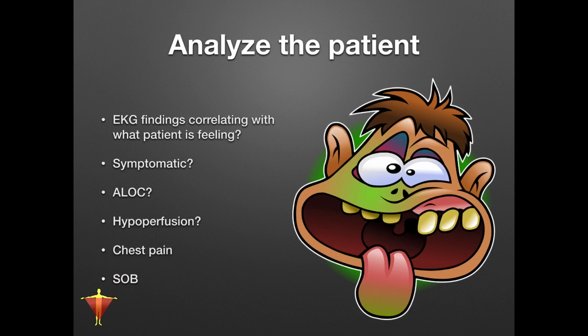Right? All these things are just things we want to be able to identify, because again, we're treating our patient. We're not treating our numbers. We're not treating what the monitor is trying to tell us.